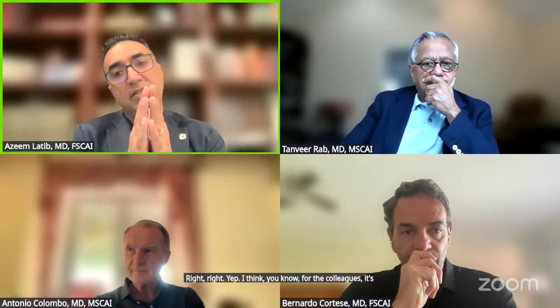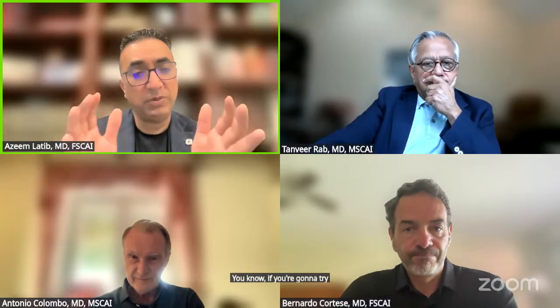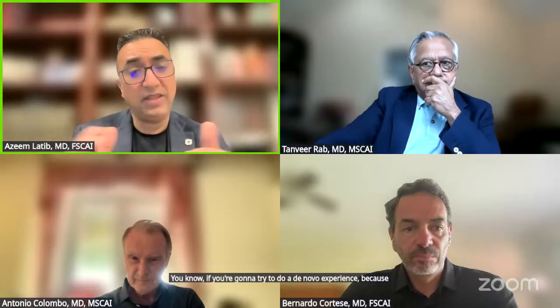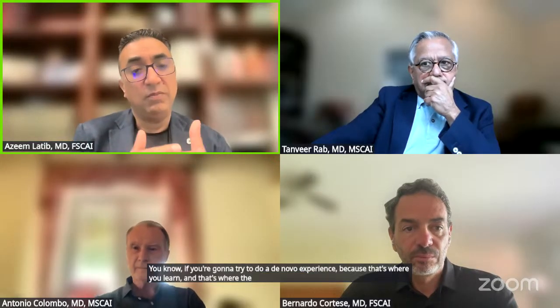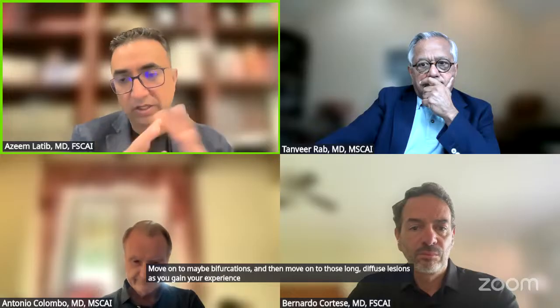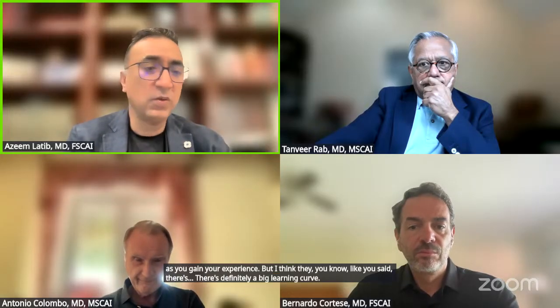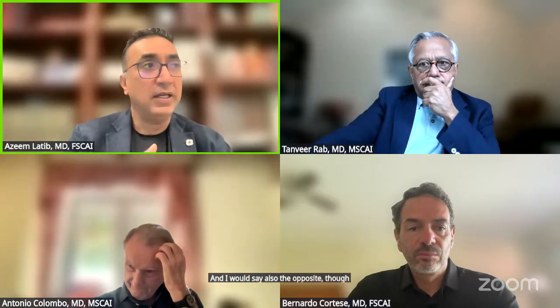Yeah. I think, for the colleagues, start with small vessels if you're going to try de novo experience, because that's where you learn and that's where the risks are smaller. Move on to maybe bifurcations and then move on to those long diffuse lesions as you gain your experience. But I think that, like you said, there's definitely a big learning curve.